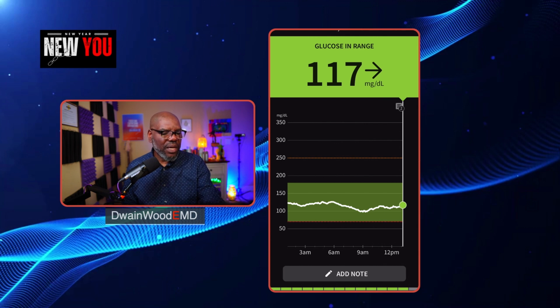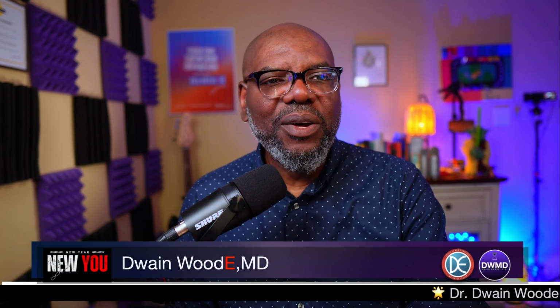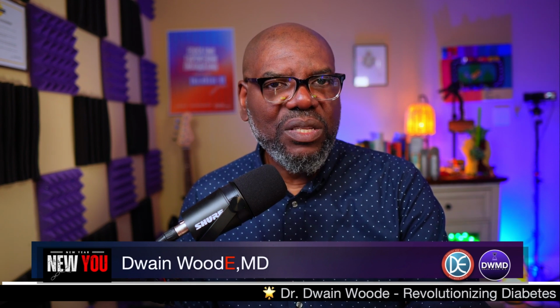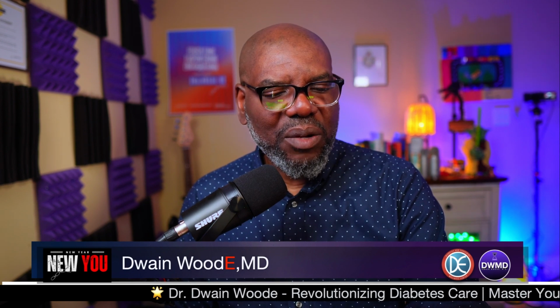And we will come back and we'll do other shows where we review some of the others, several pieces of software that I use. So continuous glucose monitors, and we'll come back and we'll look at other things. Remember, our goal is to get healthy. Our goal is to put our diabetes in remission.